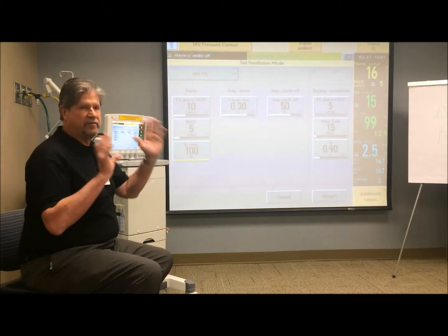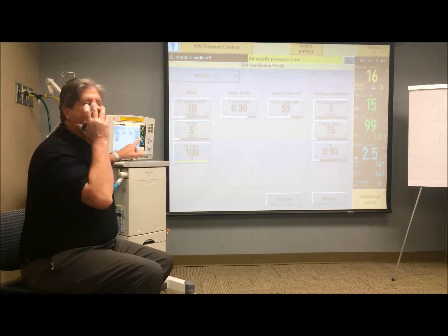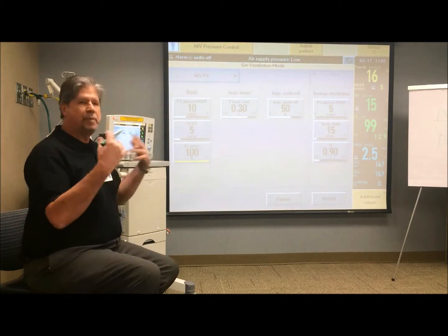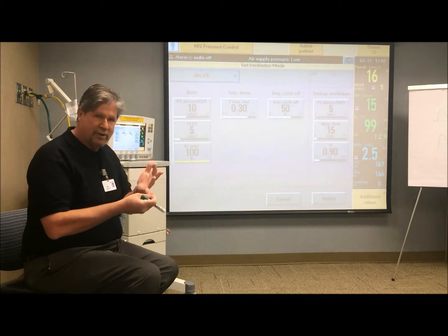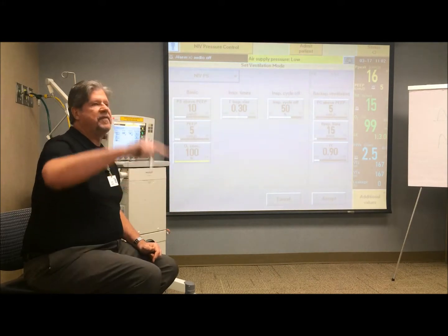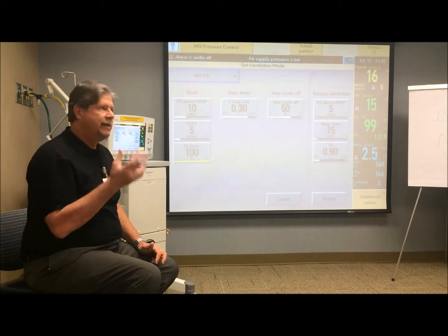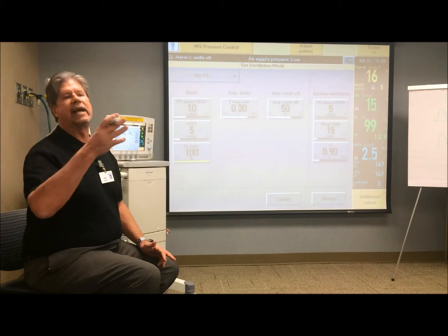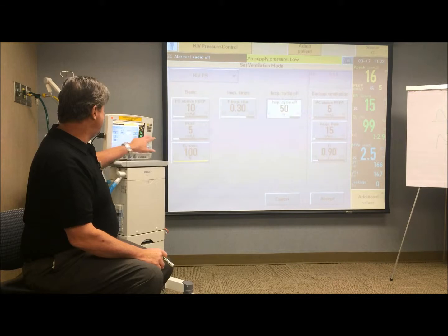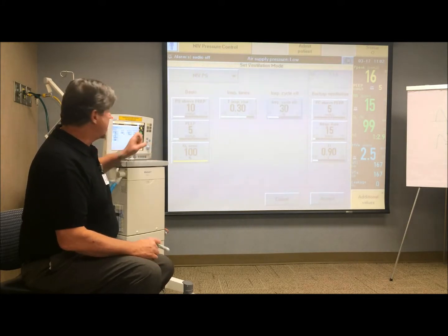But in non-invasive, just talking about leakage, it's set higher to help you compensate for the leak that might occur, so the ventilator goes up and terminates sooner. But now this patient that's apprehensive, you set your upper pressure limit at 30, you set your inspiratory rise at 30, but this is still set at 50, so it's cycling off sooner than he would like it to, and he's thinking, they are trying to suffocate me, they're not allowing me to take a nice deep breath, so they get a little agitated.